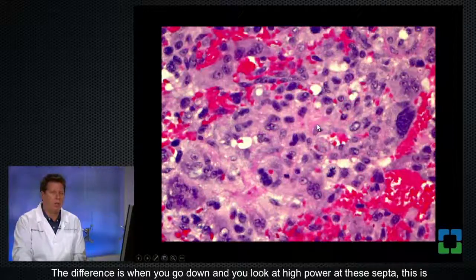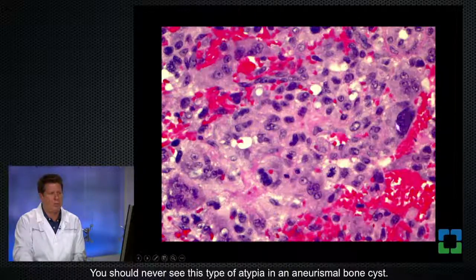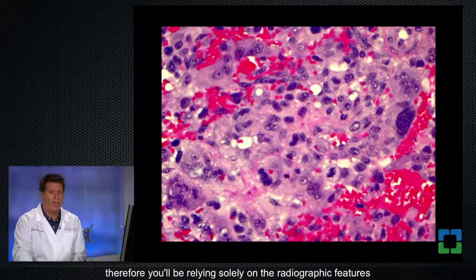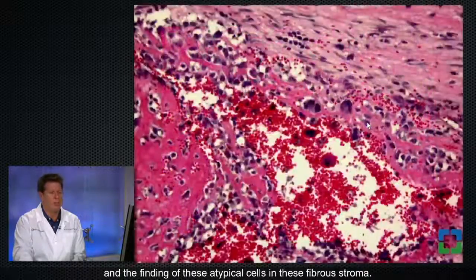The difference is when you go down and you look at high power at these septa, this is where you see the atypical cells that define telangiectatic osteosarcoma. You should never see this type of atypia in an aneurysmal bone cyst. So this finding is virtually diagnostic of telangiectatic osteosarcoma. Bear in mind that this tumor may have very minimal osteoid present, and therefore you'll be relying solely on the radiographic features and the finding of these atypical cells in these fibrous stroma.